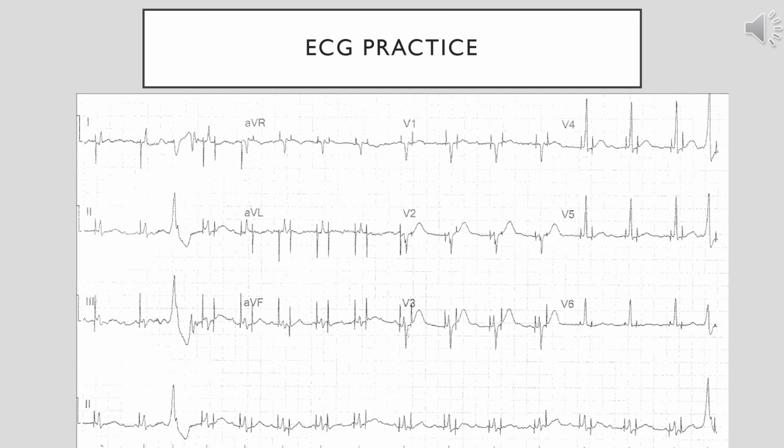Premature ventricular contractions can be quite normal in some populations, even in younger adults in their 30s and 40s. They tend to become more common in elderly years, but premature ventricular contraction, if just seen every now and then, it's not a big deal. If we see them over and over or in running beats, then we start to become a little more concerned about these ventricular contractions. This patient needs evaluation to see why this pacemaker isn't working correctly.